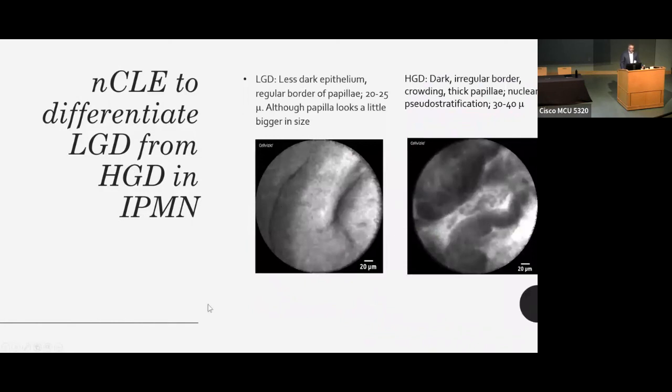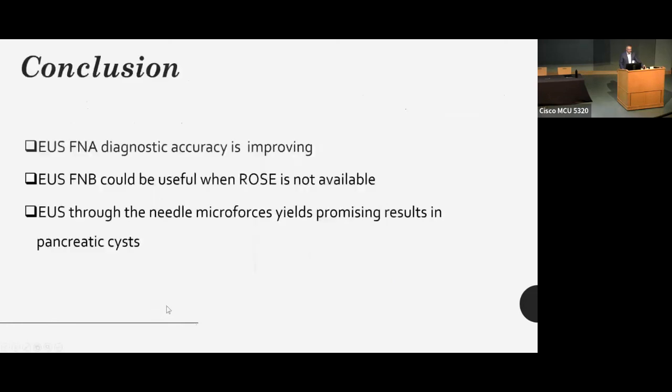Obviously, the procedure is a little bit time consuming because you have to give fluorescein first and wait for it to go to the pancreatic cyst. But we're doing a trial and we have promising results combining it with other methods. But I would say right now, virtual biopsy is still in the research phase and has not picked up to be something standard that should be done.